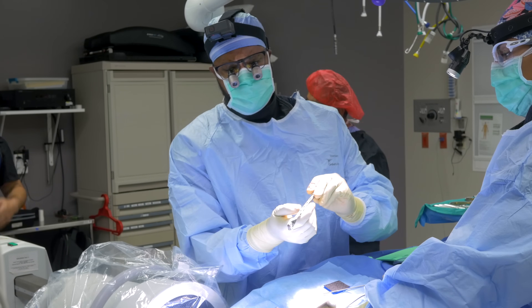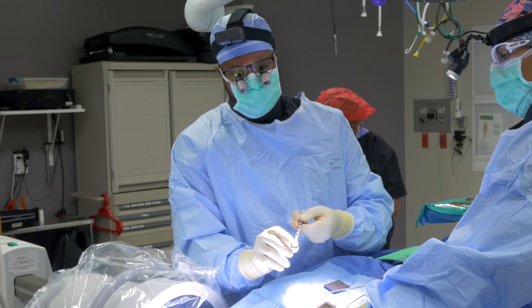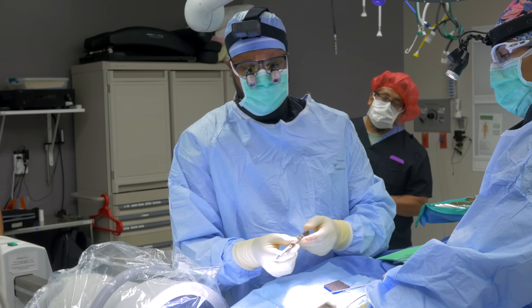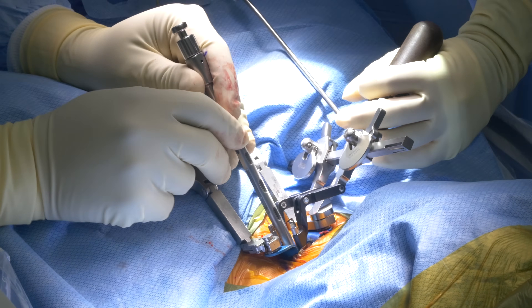This is the arthroplasty device here. It has a center kind of core, and it has these little spikes into the implant. Those will grow into the bone over the next few weeks.